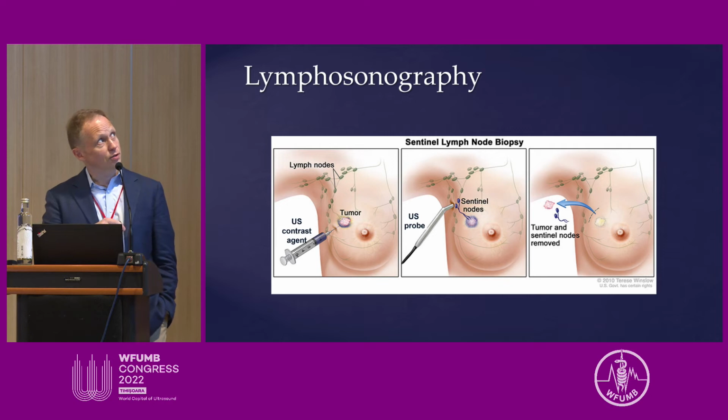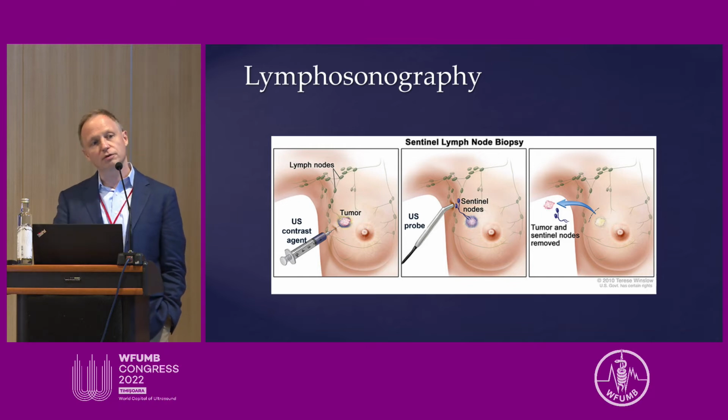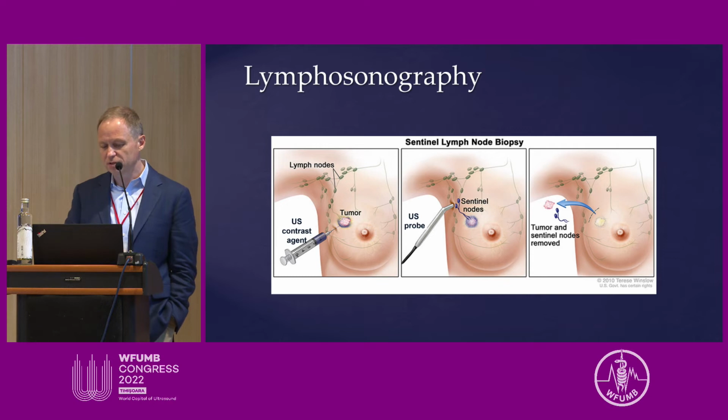After you inject your ultrasound contrast agents, we usually very gently massage the skin around the nipple and the breast tissue for about 5 to 10 minutes, but very gently.